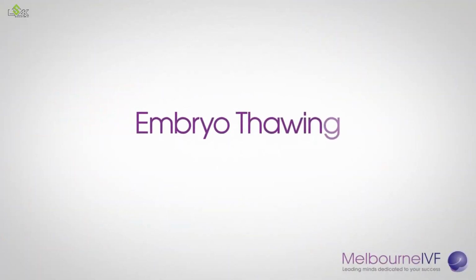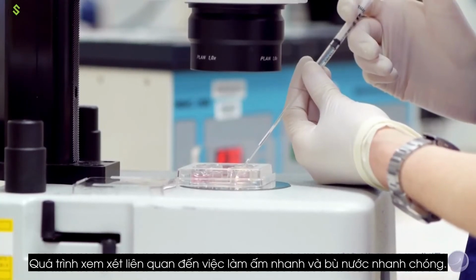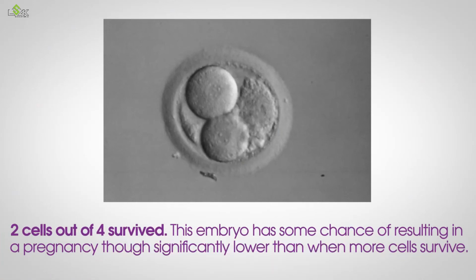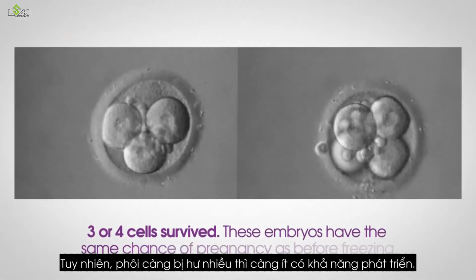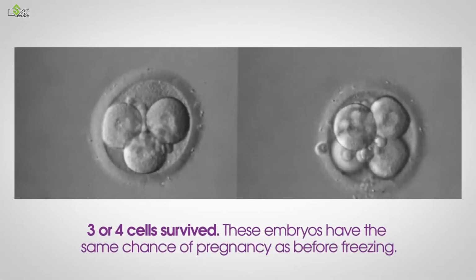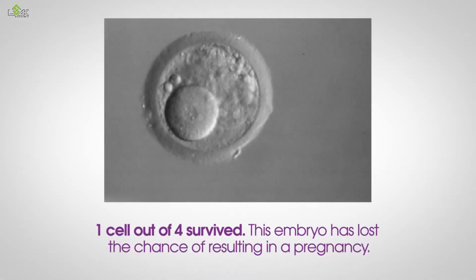Embryo thawing. The thaw process involves rapidly warming and rehydrating the embryos. Sometimes individual cells within the embryo are damaged by the freezing process. These embryos can still go on to produce a healthy pregnancy. However, the more the embryo is damaged, the less likely it is to develop. Sometimes all of the cells within the embryo are damaged. In this case, the embryo will not be transferred.